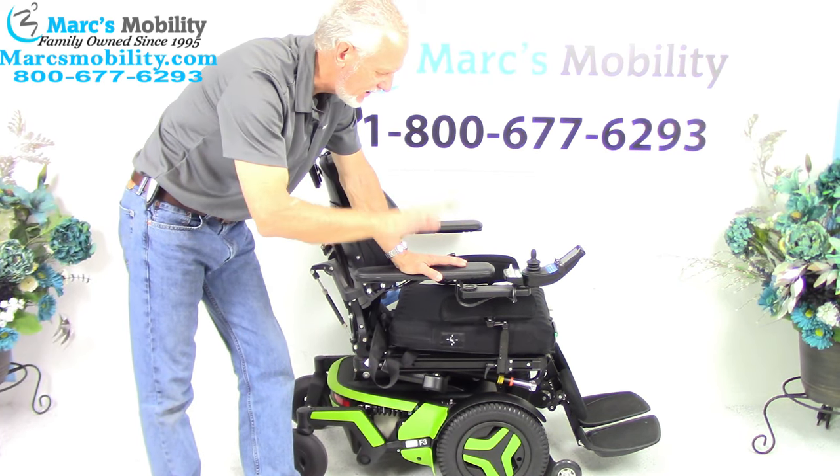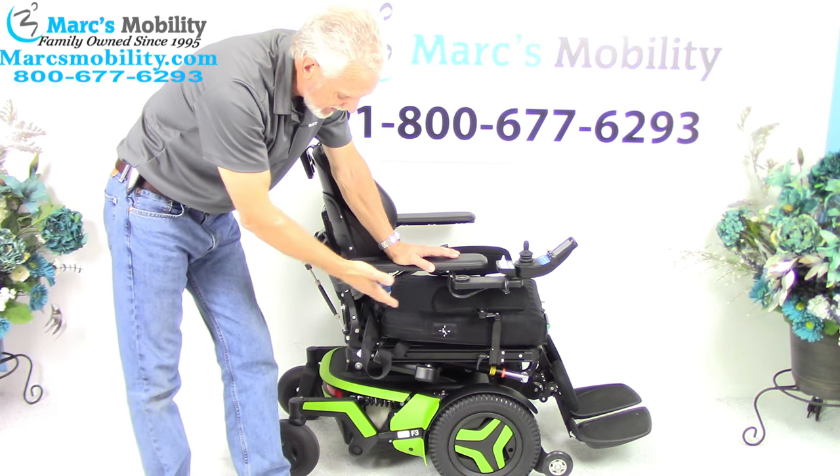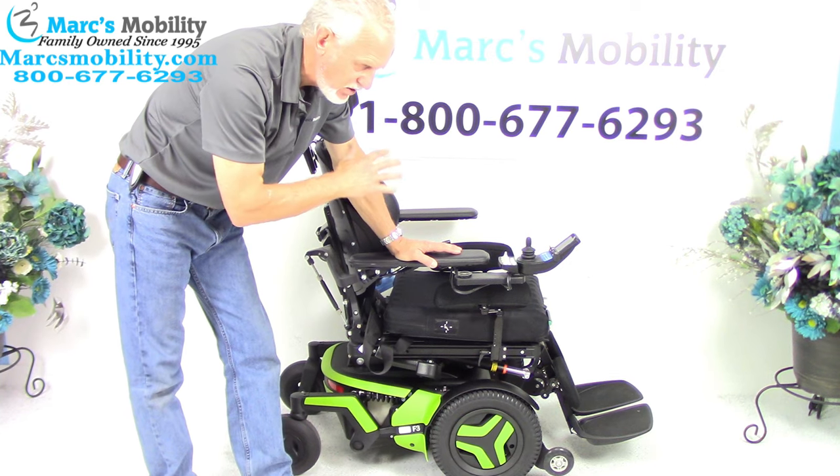Just electric tilt, electric recline, electric legs. It has less than two miles. It's the newest model — neon green — a beautiful power chair in new condition.